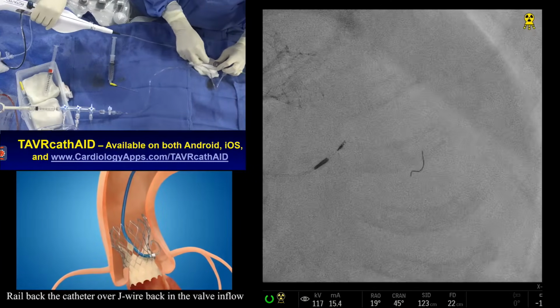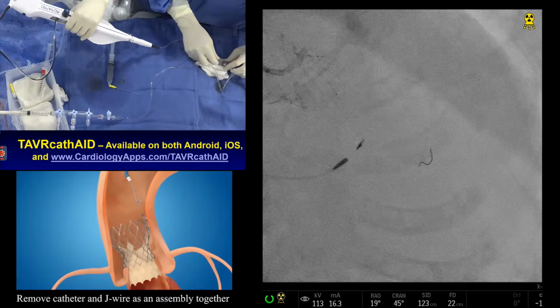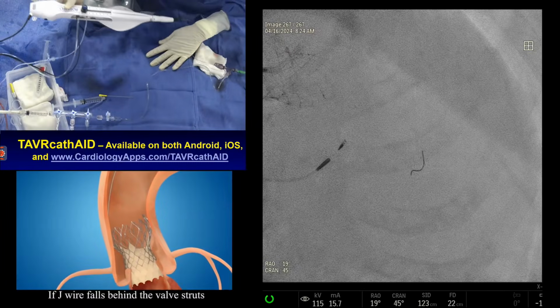So our answer to that is, if you are very good at radial, this could be a good case for radial. Only one question: remember in these cases, radial as such.